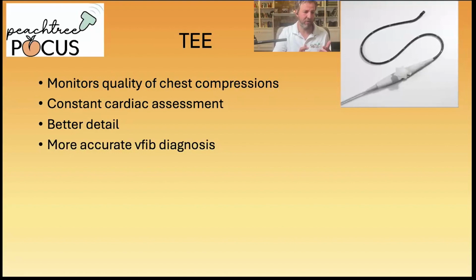It's not available everywhere yet. As we can see on the chat, only one person said it was available. It's not available in my emergency department, but it is available in a fair amount of EDs and ICUs, and it's where we're headed in the future of ultrasound and resuscitation.